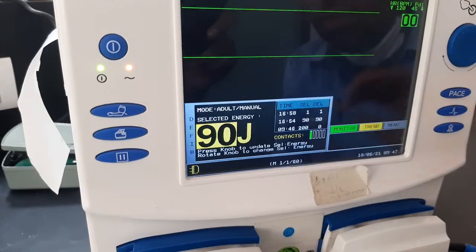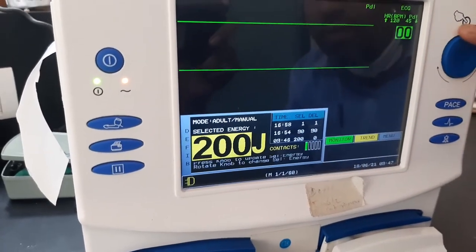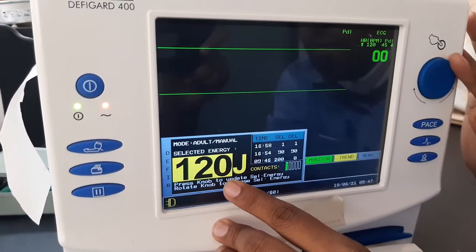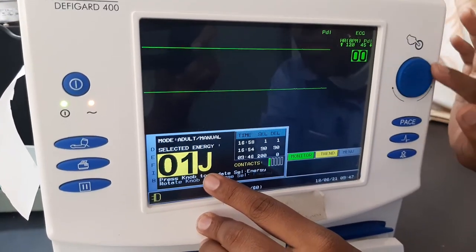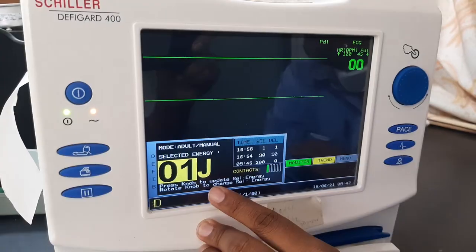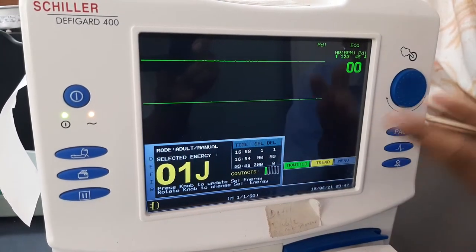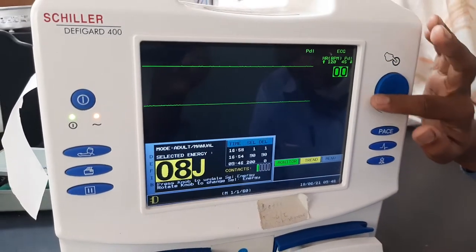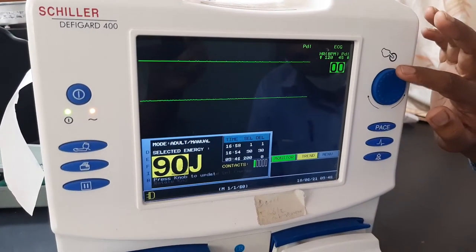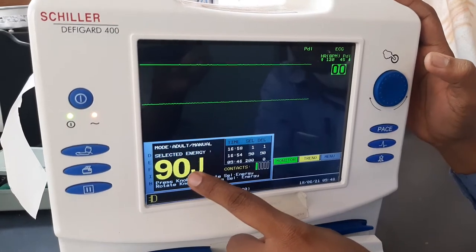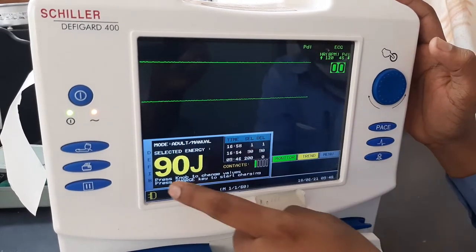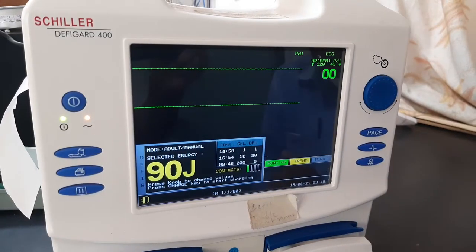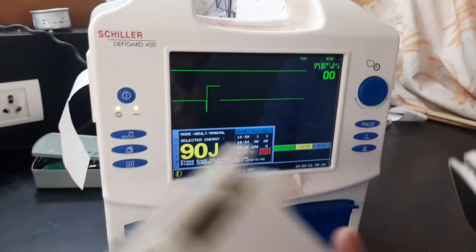With this defibrillator you can select a maximum of 200 joules and a minimum of 1 joule — meaning you can use it for neonatal, pediatric, as well as adult patients. Now suppose I am going to select 90 joules — I have selected 90 joules and long-pressed to confirm. So 90 joules has been selected.